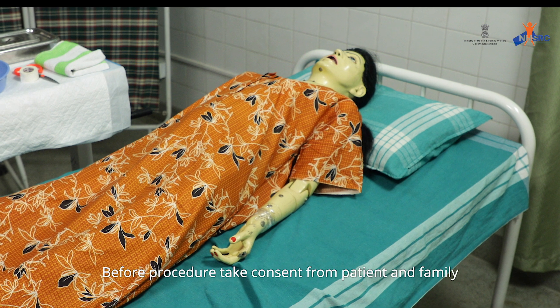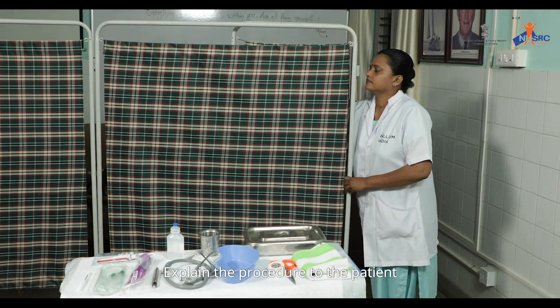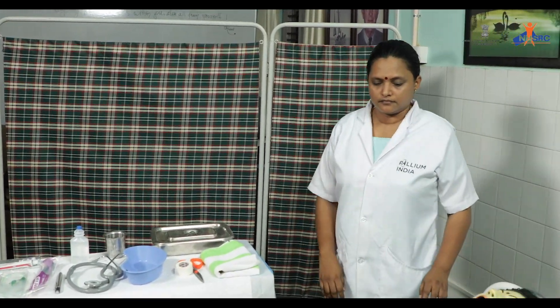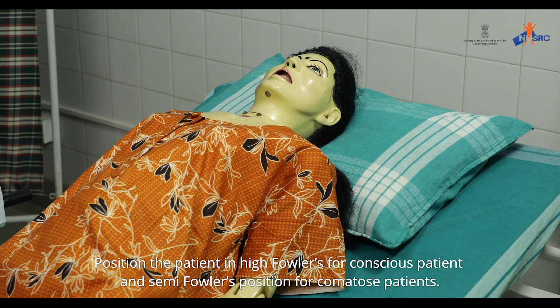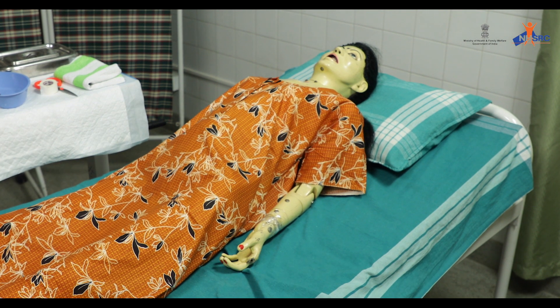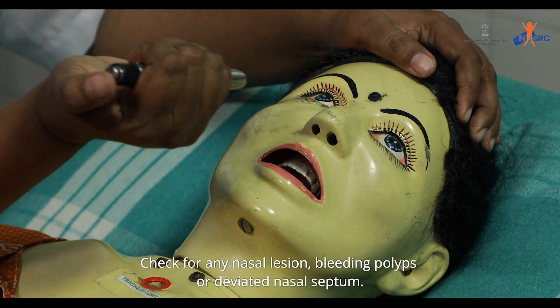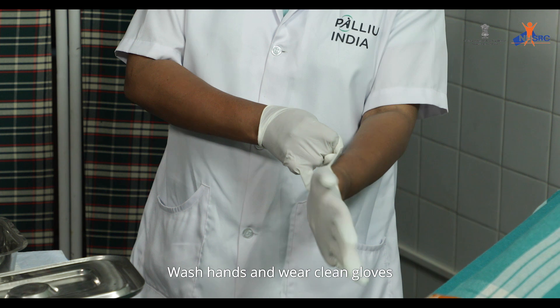Before the procedure, take consent from the patient and family, and explain the procedure to the patient. Ensure privacy. Position the patient in high Fowler's for a conscious patient and semi-Fowler's for comatose patients. Check for any nasal lesion, bleeding, polyps, or deviated nasal septum.